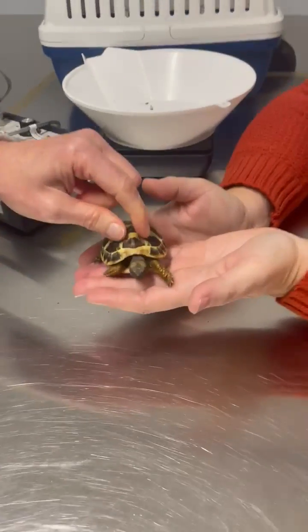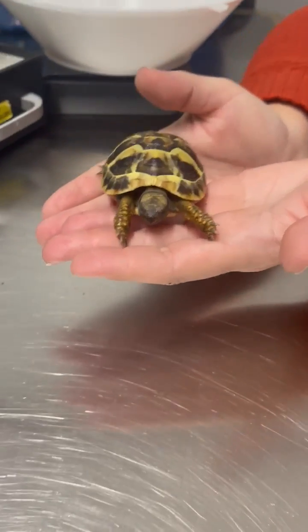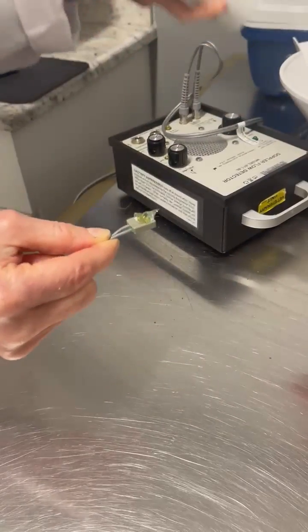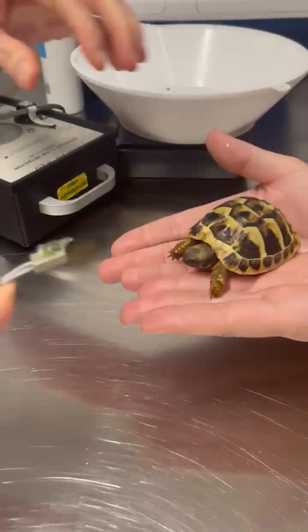This is Tucker. He's a little Hermann's tortoise and he's adorable. He's so little. And we're going to take his heart rate with this little instrument called a Doppler. This is really the only way you can take a heart rate on a tortoise.